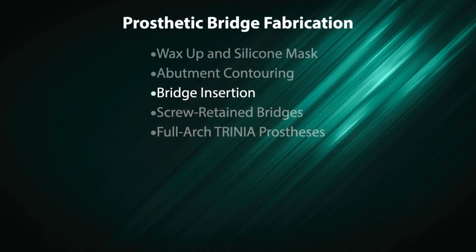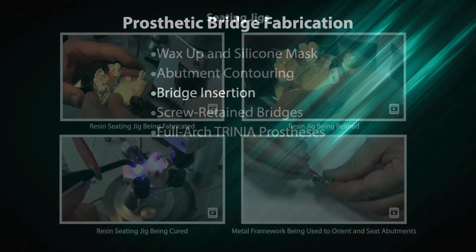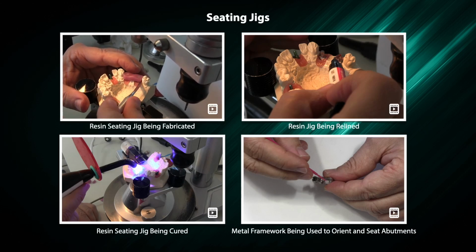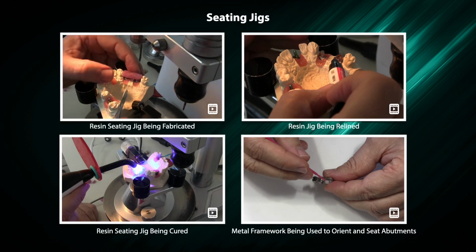Bridge insertion. Seating jigs. Resin seating jig being fabricated.